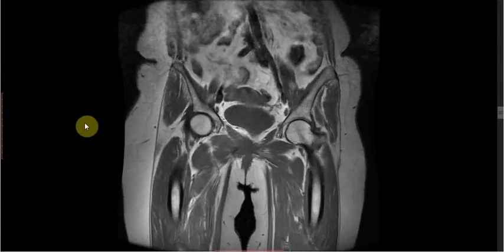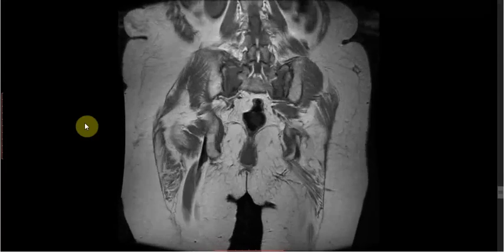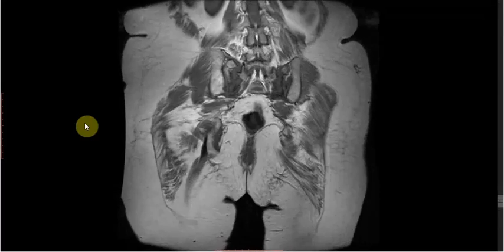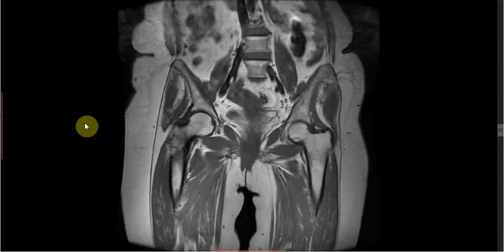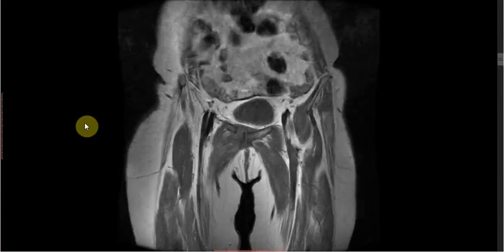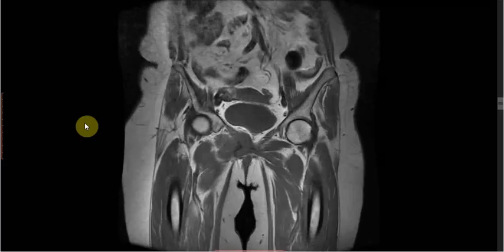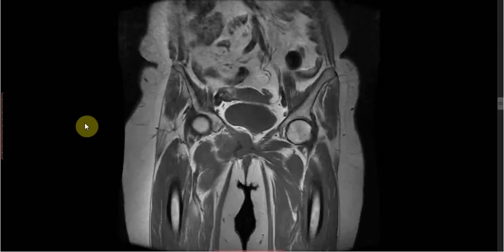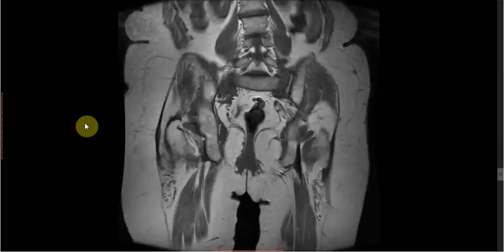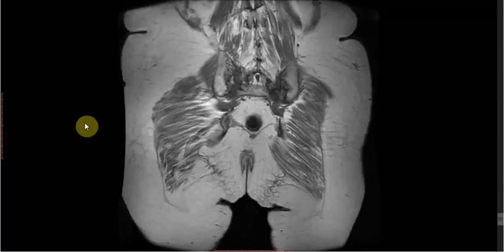In this case, we can see there is presence of sacral insufficiency fracture as well as pubic ramus fracture. To summarize: the first case was a young patient with a simple bone cyst having a pathological fracture, and this second case is an elderly osteoporotic female with sacral insufficiency fracture and pubic ramus fracture.